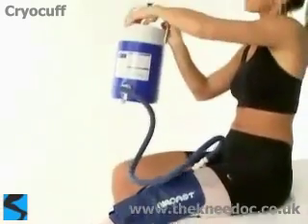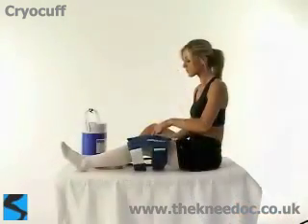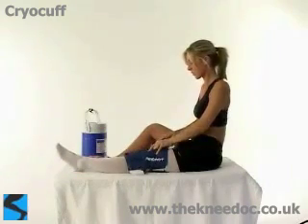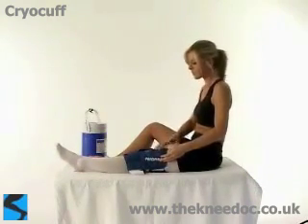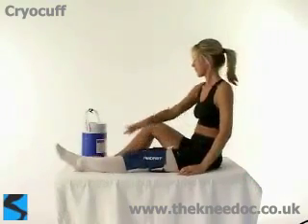There are two straps used to fasten the Cryocuff on the leg. The one above the kneecap can be pulled relatively firmly, but the one below the kneecap must be kept loose, otherwise your calf will swell as the Cryocuff tightens up.